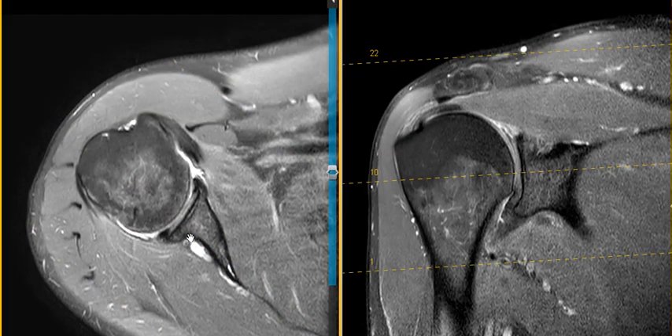On this axial view we can see a dark triangle in the back — this is the posterior labrum — and this is the anterior labrum in front. This is the cup. On this view we should see the superior labrum, which is completely torn, and the inferior labrum.